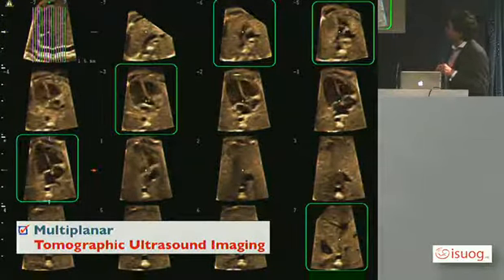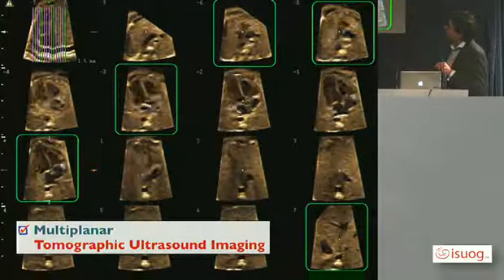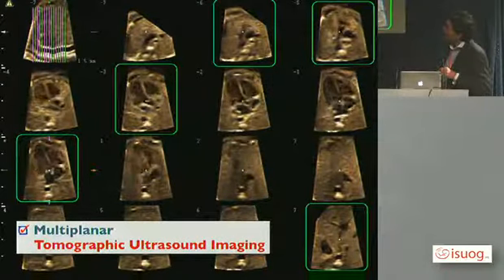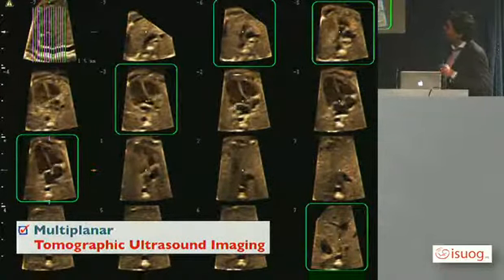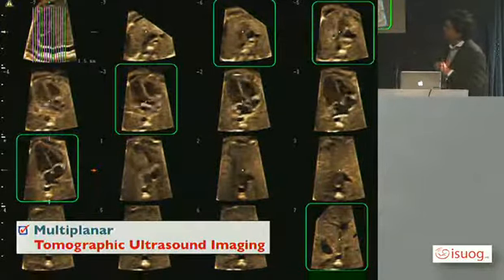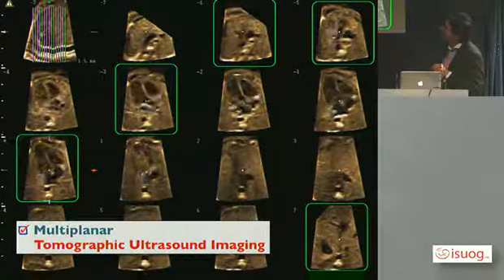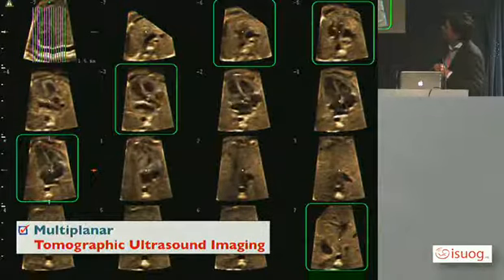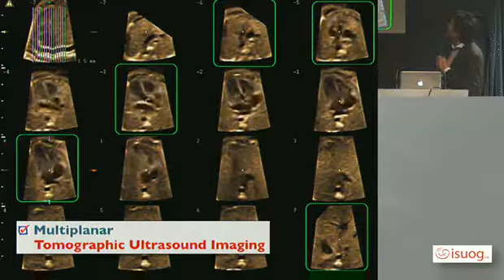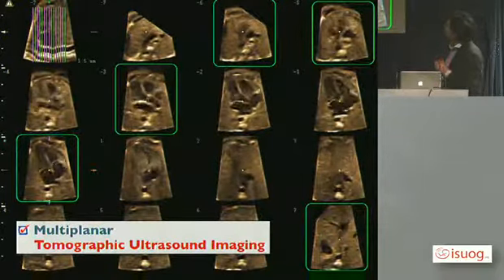Then you can move to the next step and you can choose the distance between all the slices, and you can always choose the number of slices that you want. Here you can have a 4-chamber view, very relevant and informative. Then to the next slide, you can move millimeter by millimeter, and here you can see that I chose 1.5 millimeters between every slice. Then we have the left outflow tract, the right outflow tract with bifurcation of the pulmonary artery, and then you will have the three-vessel and tracheal view.